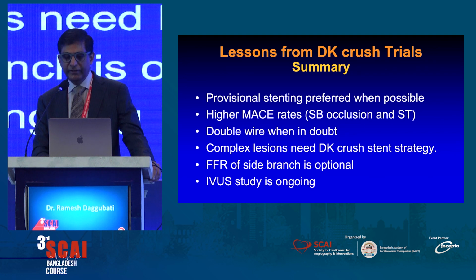Complex lesions need DK Crush stent strategy, and FFR of the side branch is optional, and an IVUS study is ongoing. FFR of the side branch was done by the DK Crush 6 study. It did not show any superiority over a conventional angiogram assessment of the side branch.